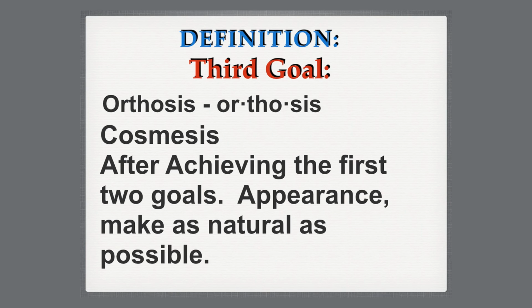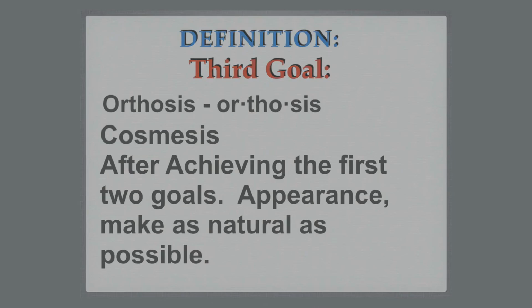And the third goal of an orthosis is cosmesis, after achieving the first two goals: appearance as natural as possible. So how we appear, how we stand, how we walk, our body posture, how we enable somebody to move more efficiently in a room and take away as many gait deviations, or eliminate all of them as much as possible, is far more cosmetic than the cute things that we may stick onto an orthosis.